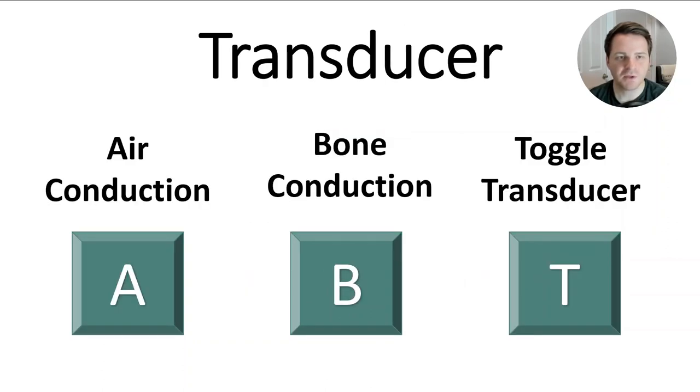The transducer can also be changed using hotkeys. You can use A for air conduction and B for bone conduction, or you can click T to toggle between transducers.